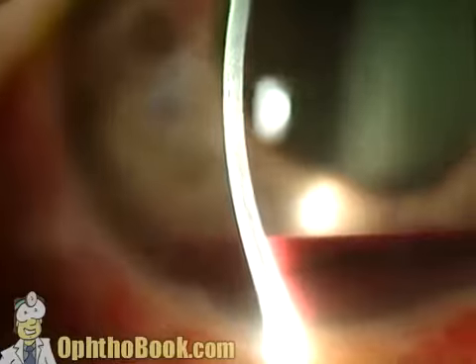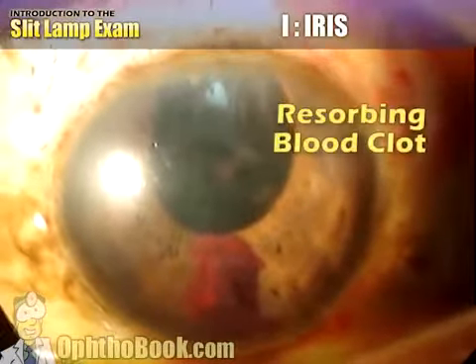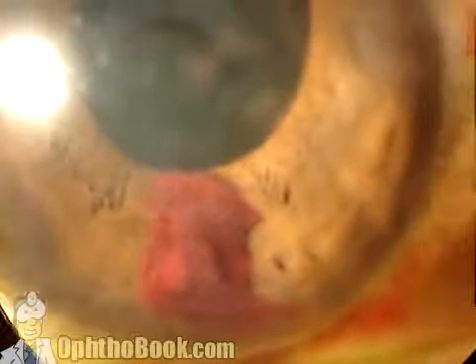And if you look closely, you can see there's 2 layers of blood, a fresh one on top, and you can see that's really plastered right up against the back of the cornea here. This is a resolving clot on the surface of the iris, and this is what we always worry about with bleeding in the eye, because days 3 to 5, this clot starts to resorb, and you can get a rebleed.